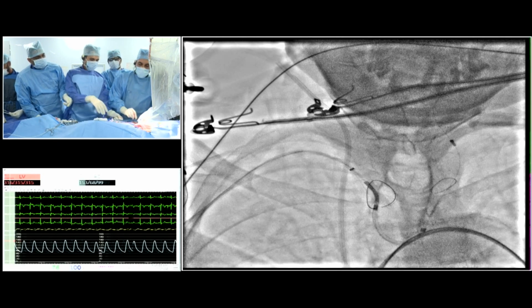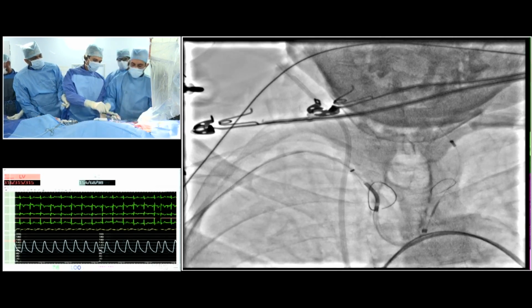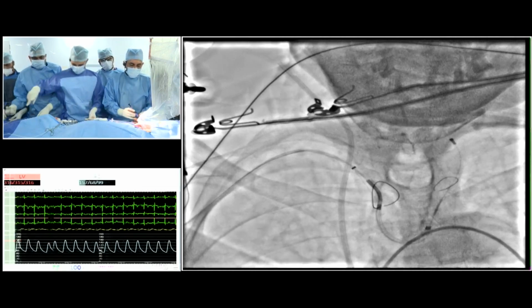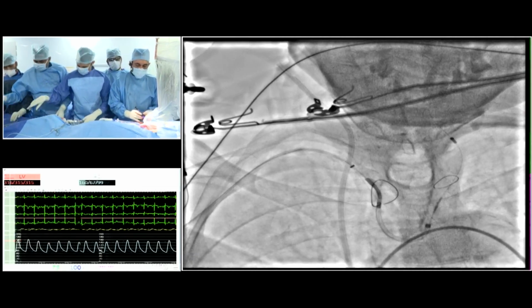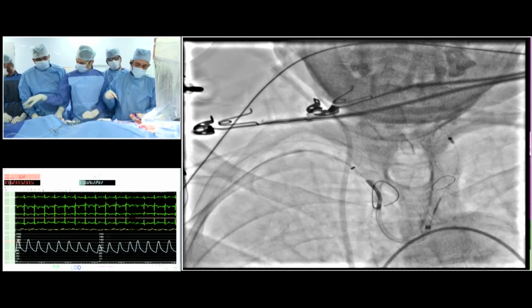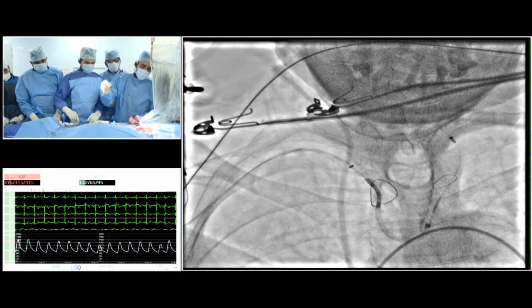We have taken 1 ProGlide. We're going to deploy a 1 ProGlide on the right side. Looks like the frame height is 17 millimeters from what I can tell.